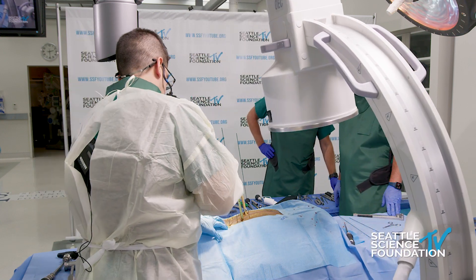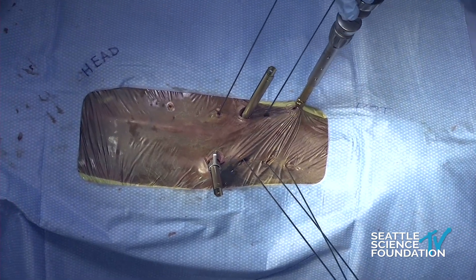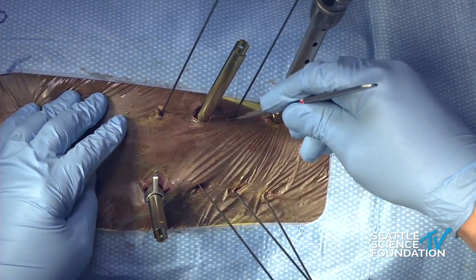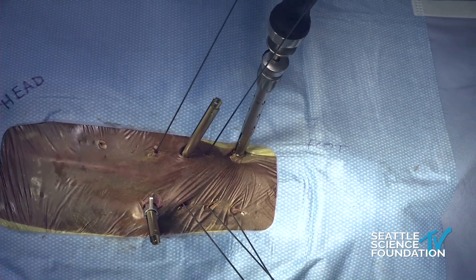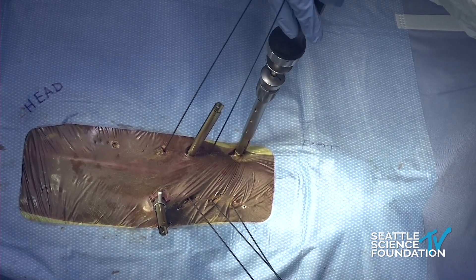The key is: getting good X-rays, understanding that these guide wires can have a mind of their own — especially if you're going to tap them — and then at the very end making sure your rod sits nicely into the construct, otherwise you're going to end up pulling your screws out.